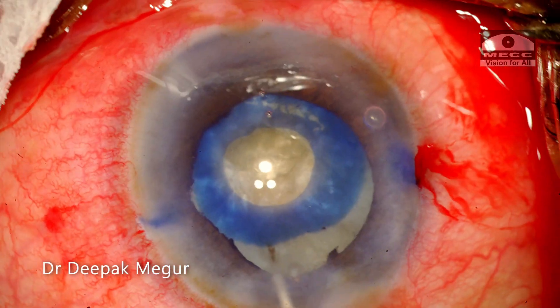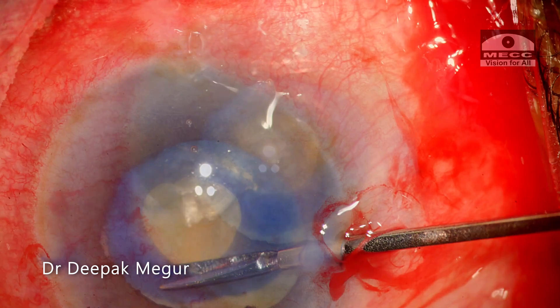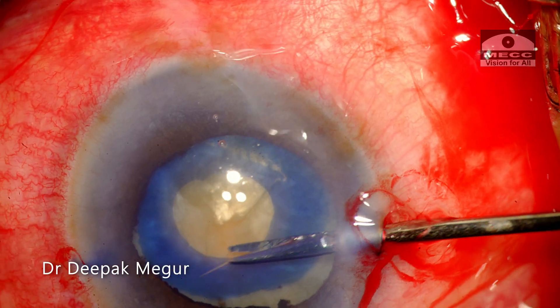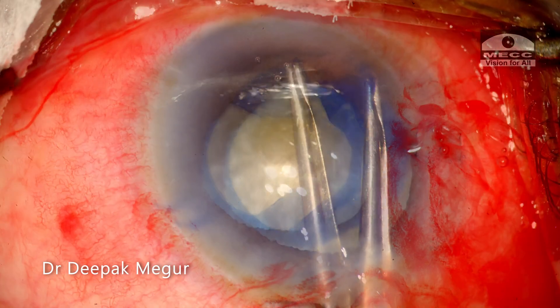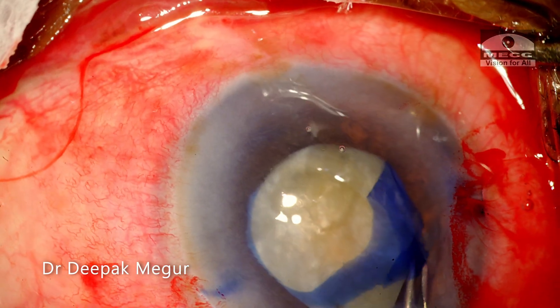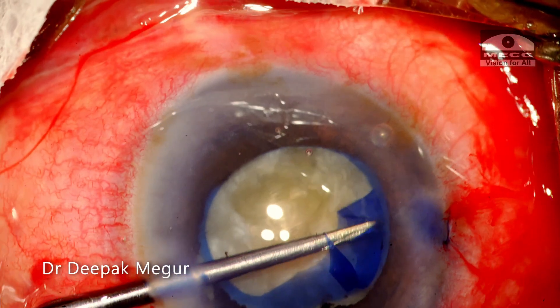During decompression, I'll be using the settings of the epinucleus — very low power, moderate flow rate and vacuum. Once decompression has been adequate, I need to perform the secondary large rhexis. A tangential cut is given using micro scissors, and then using the forceps, the secondary large rhexis is completed. The iris is prolapsing through the main wound so I use the side port to complete the rhexis.